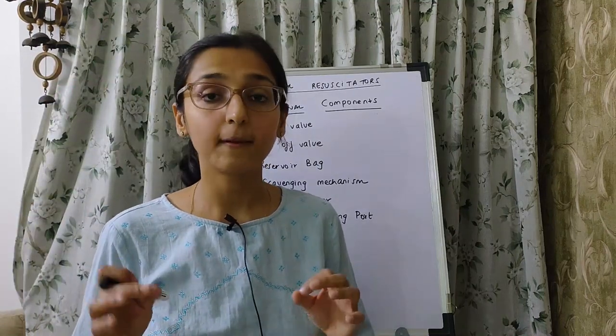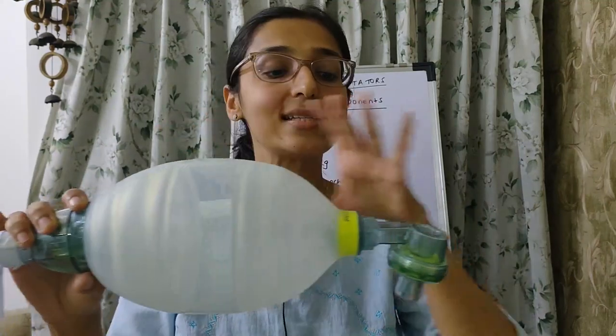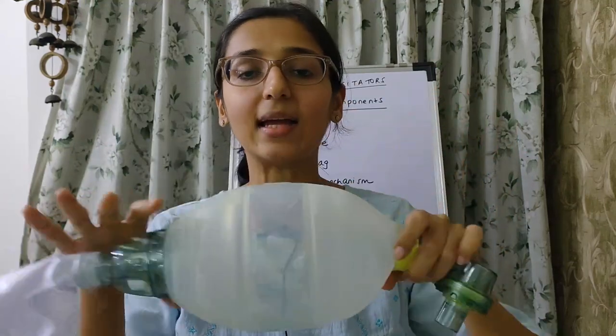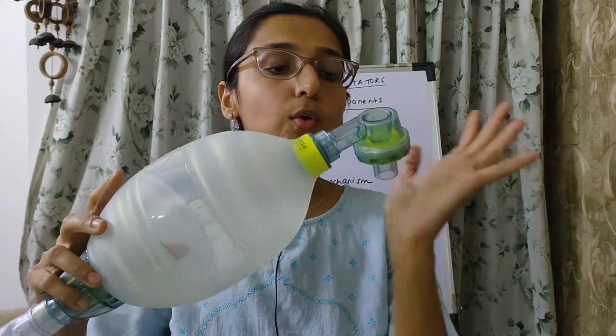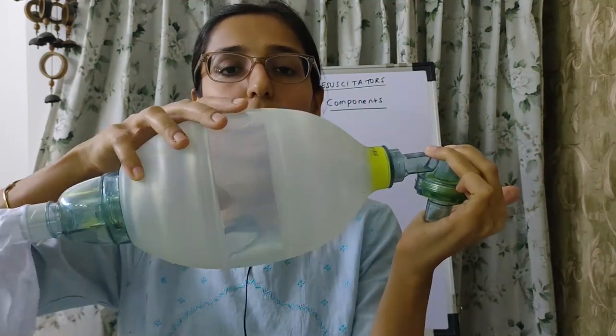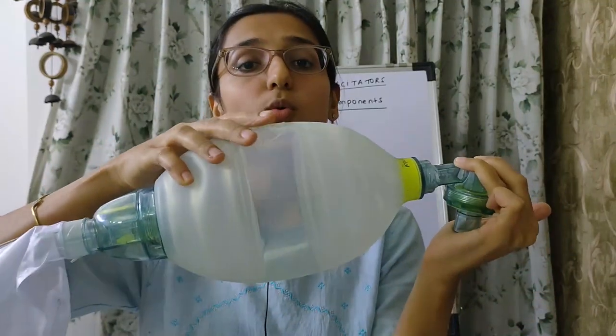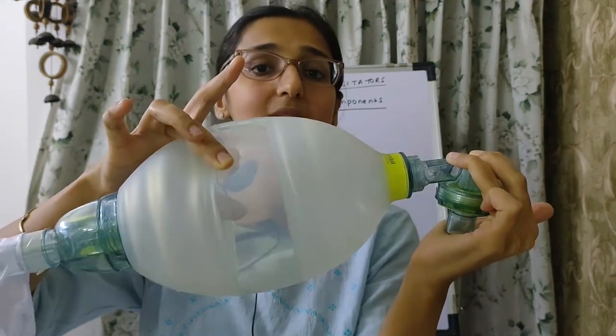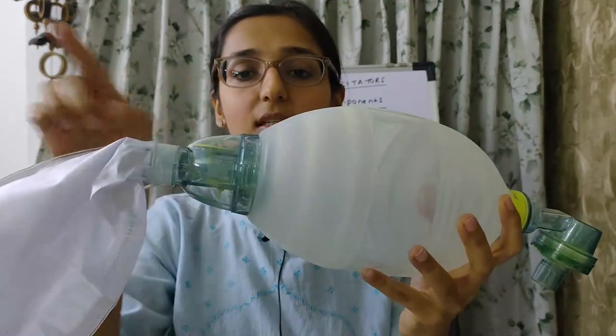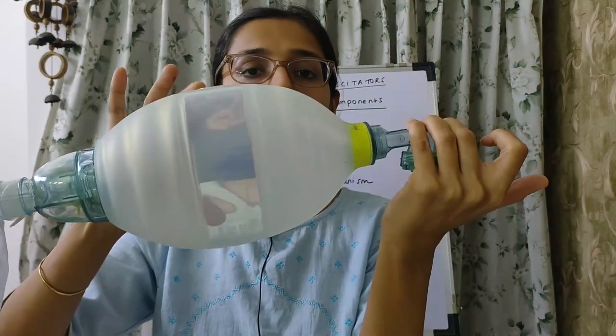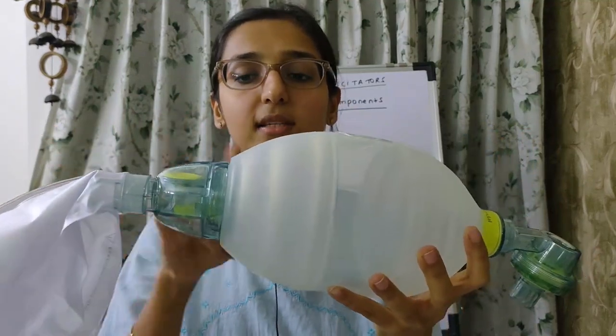Now let's see how to check the manual resuscitator. First, visually inspect it for any cracks, defects, or leaks. Second, occlude the patient port and try to compress the bag — you should not be able to compress it, confirming there is no retrograde gas leakage and the valve is patent.